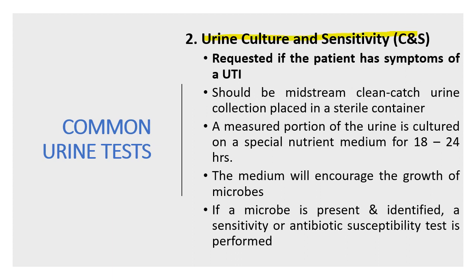Next, we have urine culture and sensitivity. Class, itong urine culture and sensitivity, hindi siya dinadala sa clinical microscopy. Dinadala siya sa bacteriology or microbiology kasi doon ginagawa yung culture and sensitivity. So it is requested if the patient has a symptom of UTI. So ulit lang, dapat laging midstream clean catch yung urine.